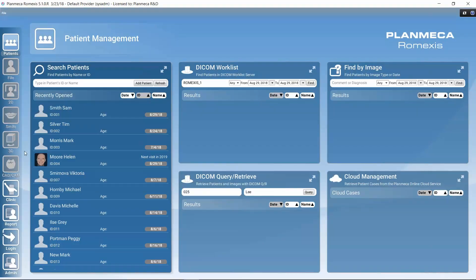That was a quick overview of the general modules and general functions in Romexis.